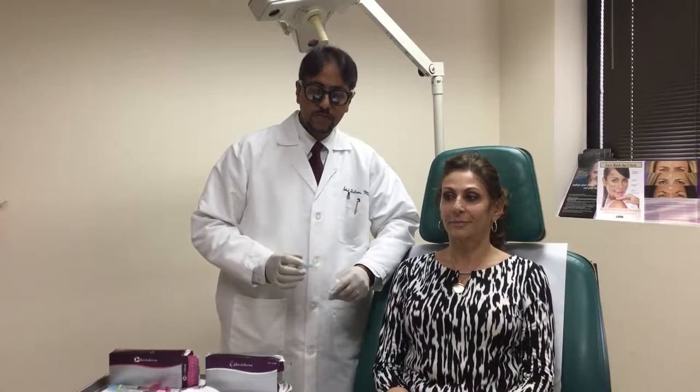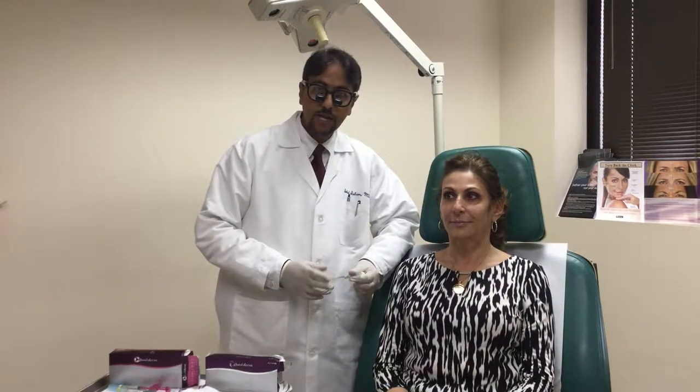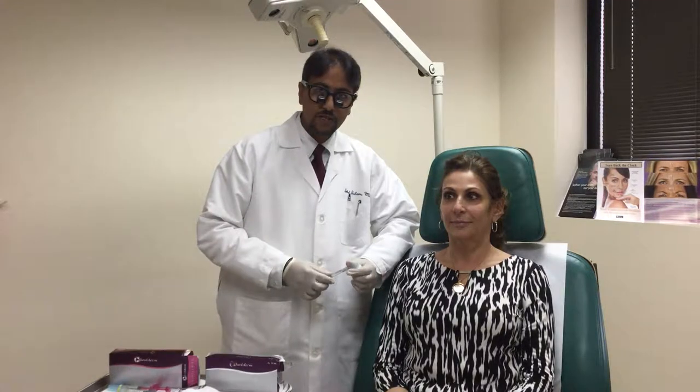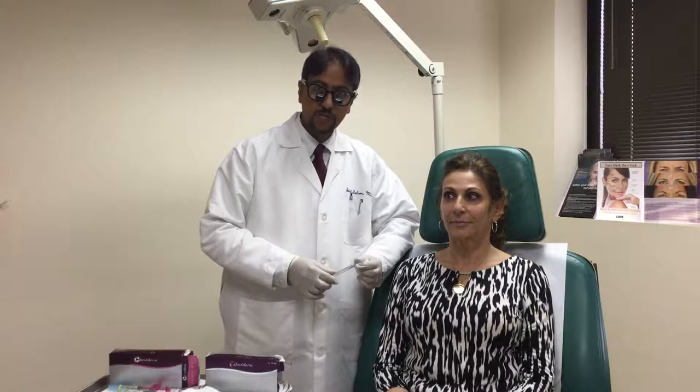Hi, this is Dr. Islam from Advanced Cosmetic and Plastic Surgery in Danbury, Connecticut. We're here with our frequent volunteer, Helen, who's been nice enough to let us do some more injectables on her.